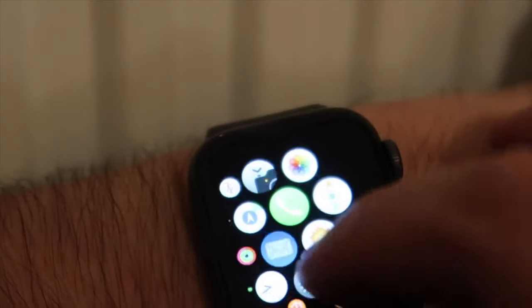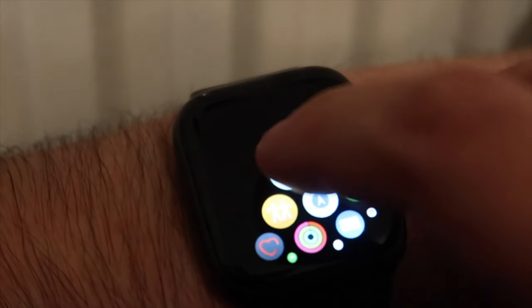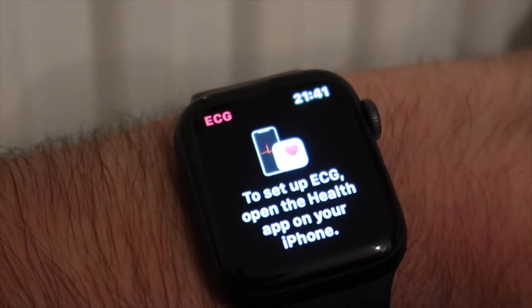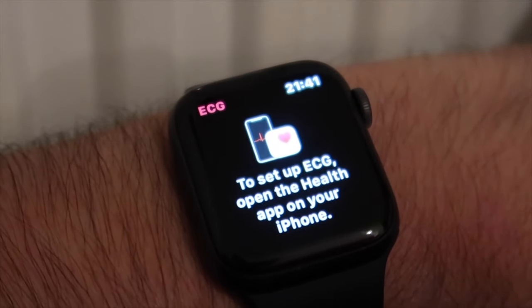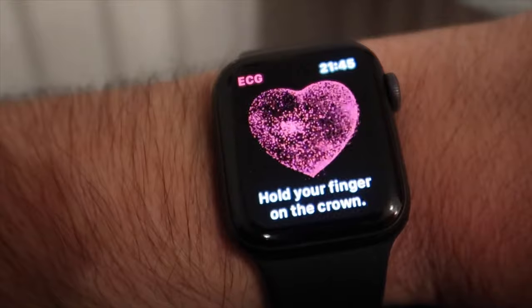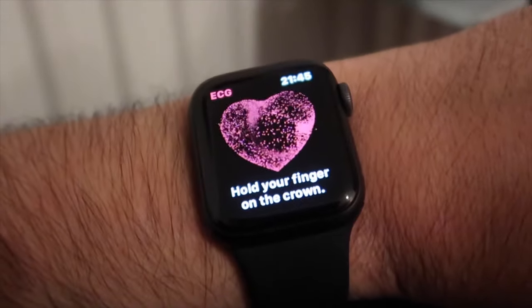So let's find the ECG app — there it is. I'll just click on that for the first time. To set up ECG, open the health app on your iPhone. Just bear with me one moment while I grab my iPhone and we'll carry on the video from there. So this is the startup screen for the ECG — I'm going to start by holding my finger on the crown, which is this button here, the digital crown, and start the process for the ECG.